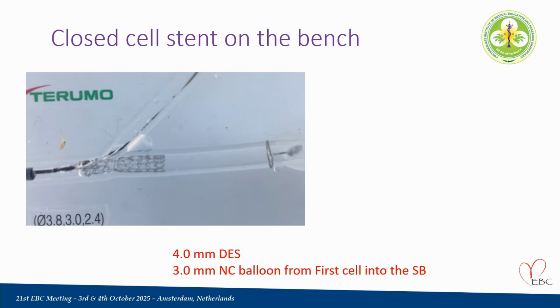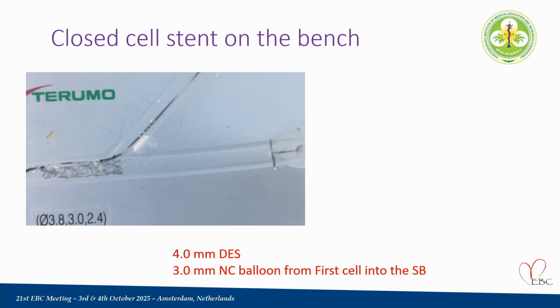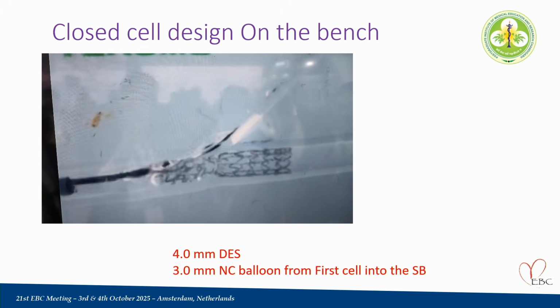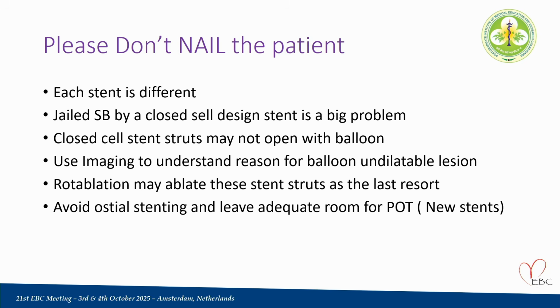And even the balloon, once it opened, got stuck in the stent struts and never came out. Thankfully, it did not happen in our patient, but it happened on the bench. I had 4 stents with me, and I destroyed 4 stents that day, where I started to dilate the proximal most closed cell, and I was not able to do it. So eventually, I will just say that please don't nail the patient.